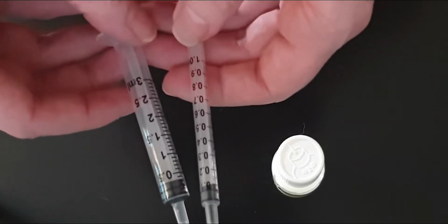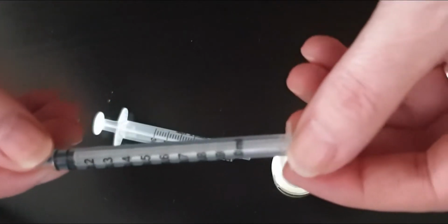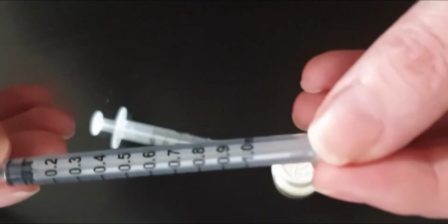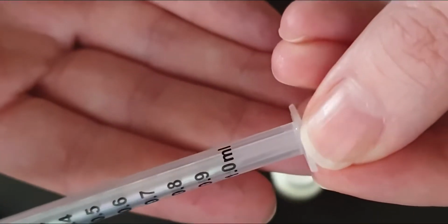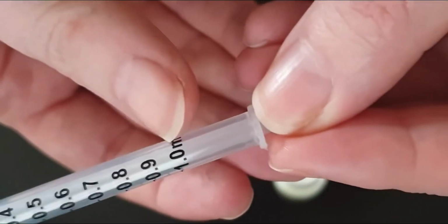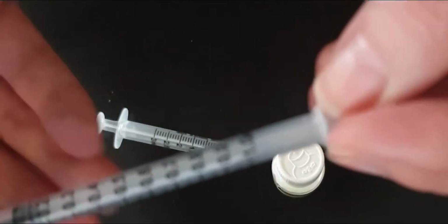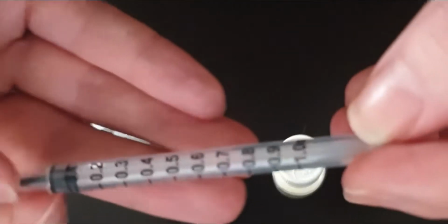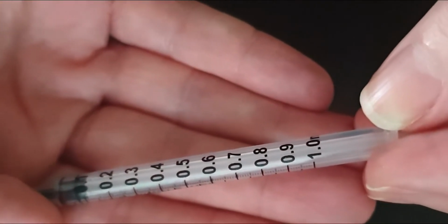These are two different syringes, so most rabbits and guinea pigs will need a 1 ml syringe. Most of our doses will be less than 1 ml. You can see the gradations on the syringe here. They go up to 1 ml at the bottom here. So that's where that mark is. Read the label, see what amount you need to give to your pet. Often it'll be within that 1 ml range.